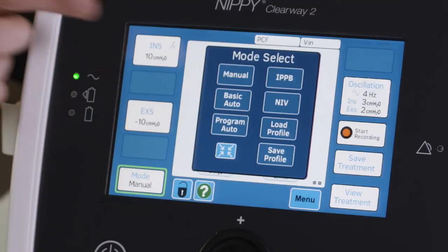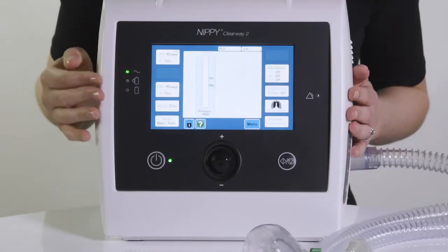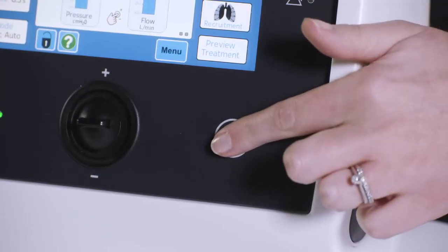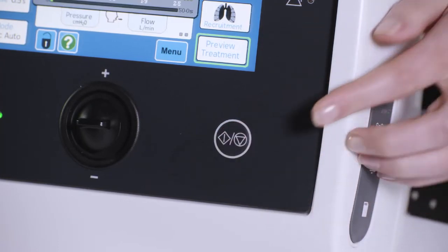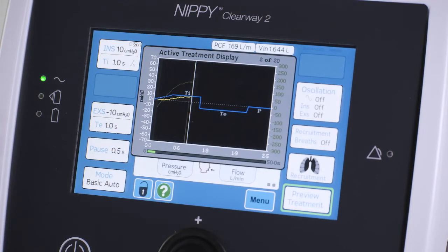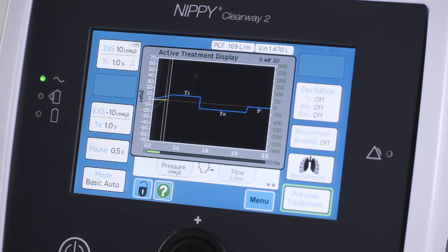Basic auto mode, where pressures are delivered from the Clearway 2 in prescribed time settings with a pause between the delivery of each insufflation and exsufflation. One insufflation followed by one exsufflation followed by one pause time delivery is called a cycle. The basic auto mode delivers up to 20 cycles at once.